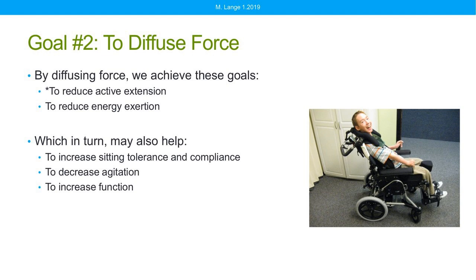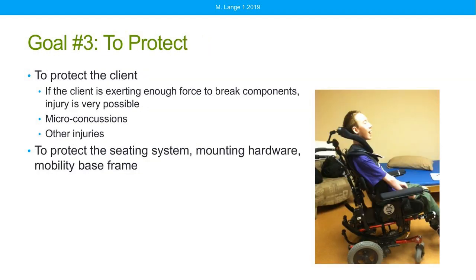By diffusing this force, we can also further increase sitting tolerance and compliance, decrease agitation, and increase function. Now the client might have a chance to move outside of those patterns of movement generated by the muscle tone and actually be a little more functional.